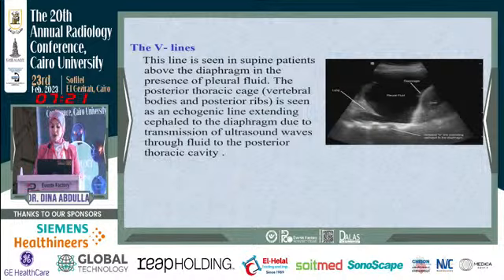Similarly, chest ultrasound is important in diagnosis of pneumothorax in comparison with X-ray. However, of course, the CT chest has the upper hand, and chest ultrasound is important in diagnosis of superficial lung consolidation, lung contusions, and laceration. They are superficial, so they can be detected. However, deeper structures are better detected by CT. Of course, we recommend the use of ultrasound in post-operative patients, ICU patients, and post-traumatic follow-up, and it's safe, with no radiological exposure, no ionizing radiation. So that's our recommendation.